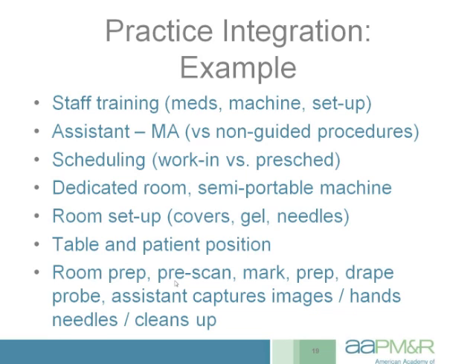I like to pre-scan. So before I do anything with prepping the skin or sterile gel, I first scan the joint because everyone's anatomy is a little bit different, just as we see with fluoroscopic procedures. Everyone is a little bit unique. So I like to know what I'm getting into before we start the actual procedure. And I will mark on the skin where the probe is and where I think my needle is going to enter. And we do non-sterile scanning before we start the procedure.